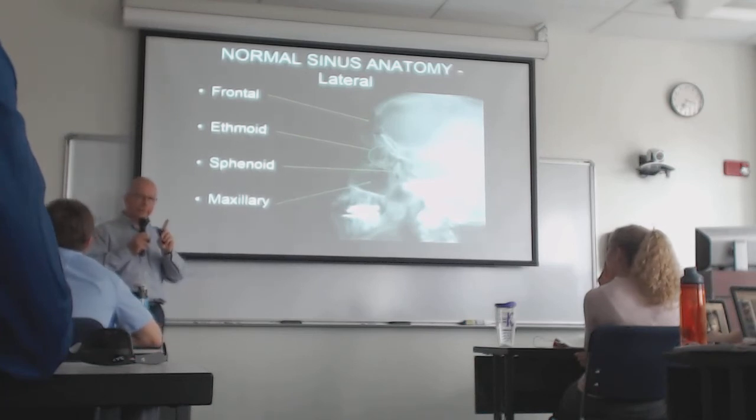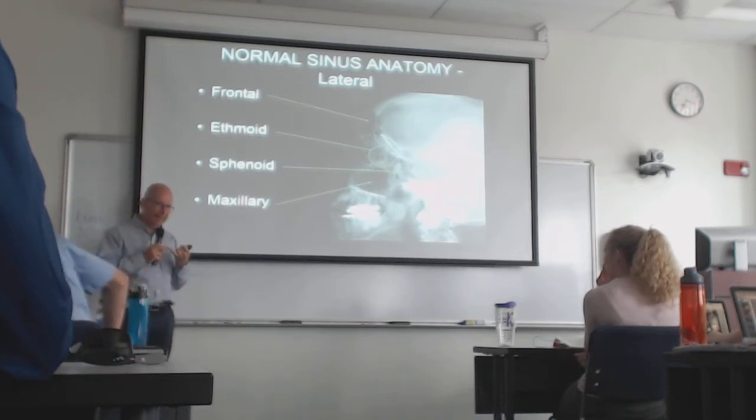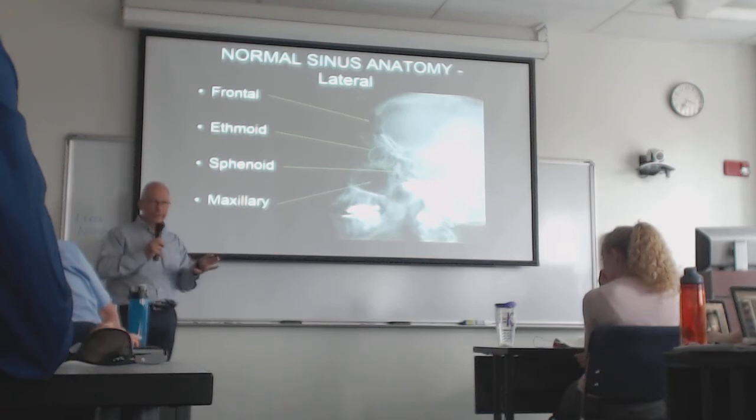I said something in the last lecture that I want to clarify. One of your colleagues was astute enough to bring it to my attention. I said that ionizing radiation requires a prescription, a doctor's order. And then I said, screening mammography does not require a doctor's order, which is true. Screening mammography is the only exception to the concept of radiation requiring a physician order, okay?